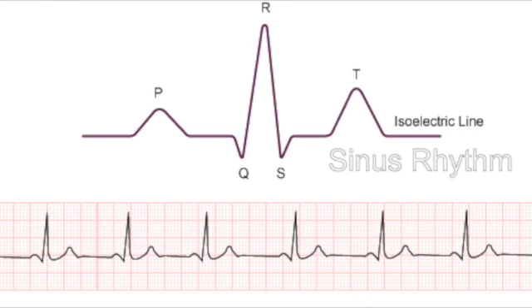So we see the P wave, we see the QRS, we see the T wave, and we kind of want to keep this basic, so we're not going to get too much into depolarization versus repolarization. But some key things that are good here is that we look like we have a nice tight QRS with a P wave, and every QRS has a T wave after it. You agree? Yeah, and I think something to be said about that is, you get handed an EKG or you print off this 12 lead and you should look at it the same way every time, right? So we look at the strip that's beneath it and we're like, okay, there's a P, so that's what I do. What's the rate? Okay, let's calculate that out.